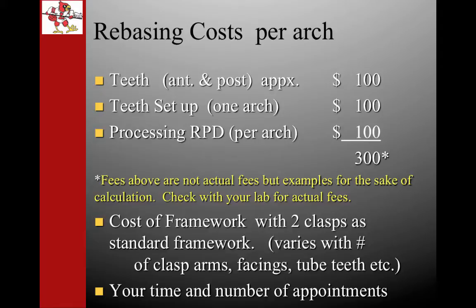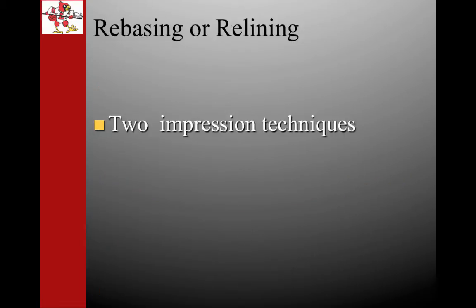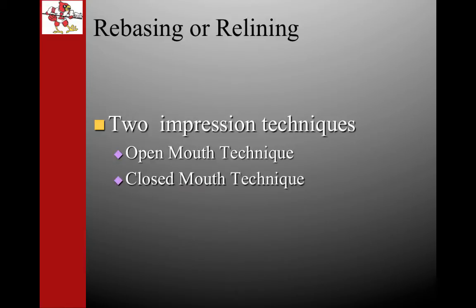So what are you going to have to charge the patient for this procedure versus the charge that would be placed on a brand new prosthesis? All this has to be considered. There are two impression techniques utilized in the rebase and reline procedures. One is the open mouth technique, and the second one is the closed mouth technique. Pay special attention to this section because it is very often part of the board examination.